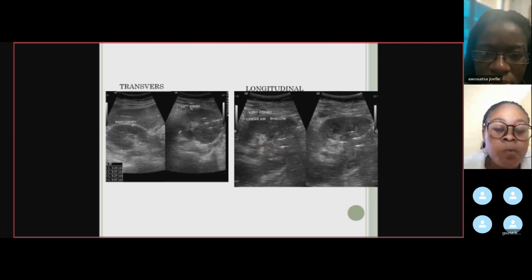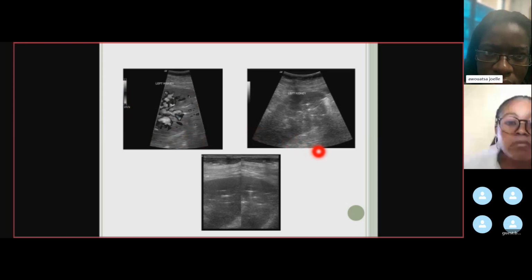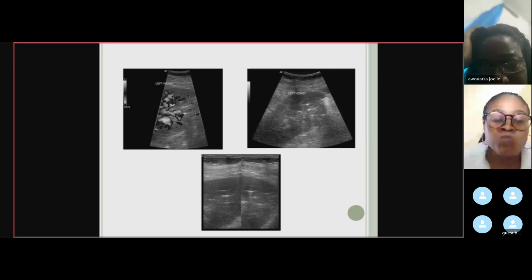of the left kidney, only of the left kidney. Okay. This is not a Doppler color flow, we are using the grayscale only. And then there is something wrong with the left kidney. Okay. Here you can see some shadows. Hyperechoic structures in the left kidney.